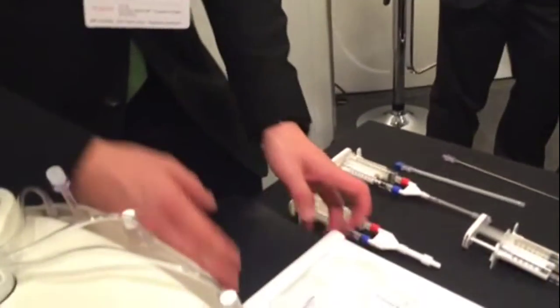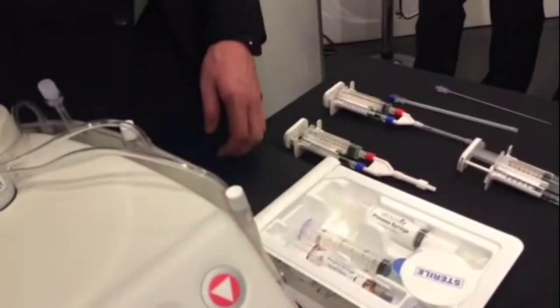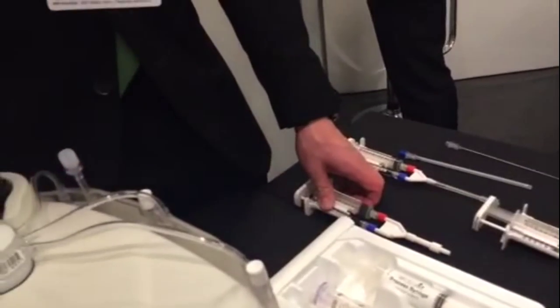With this kit, when you do the PRP, as a byproduct — as a waste product — you also prepare platelet poor plasma. With this kit you can extract thrombin out of the platelet poor plasma, so when you then mix the thrombin with the PRP, you get a gel.